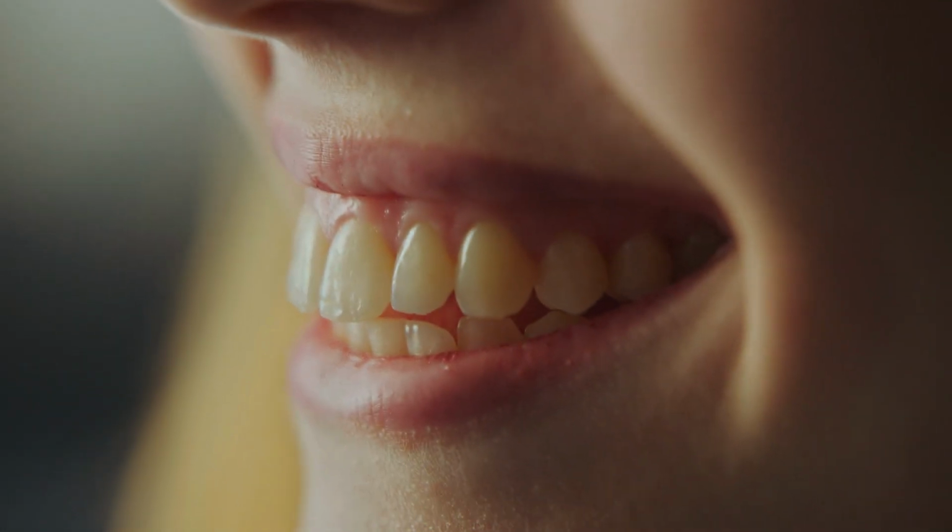When we take that 3D scan, we also take into account your bite. Your bite is how your teeth come together. So when we take that scan and make you that guard, it takes into account how the top teeth are hitting your bottom teeth. Therefore, that night guard assures that the teeth that are biting into it won't be affected by it. The biggest roadblock with patients with a custom night guard is really price.